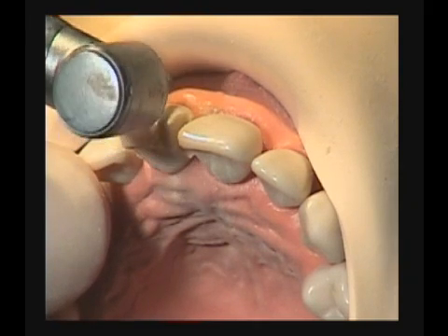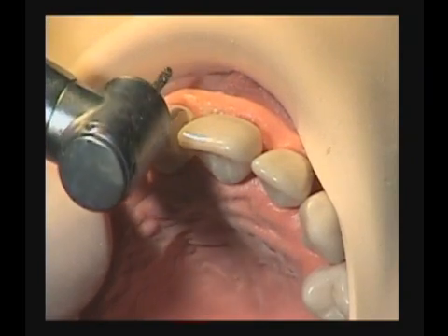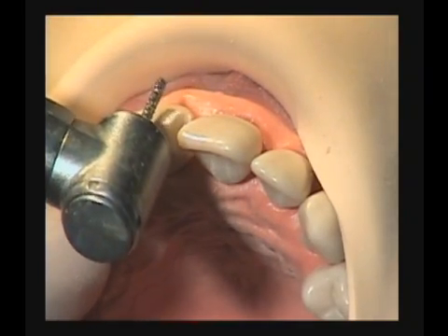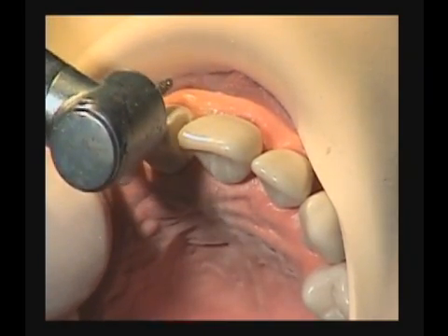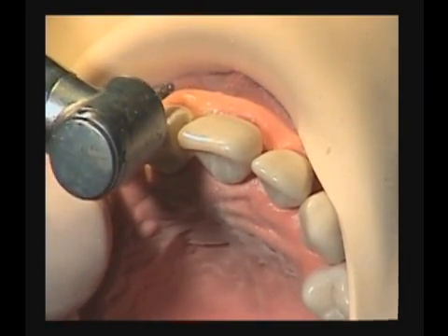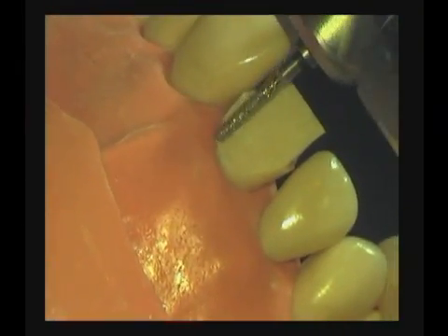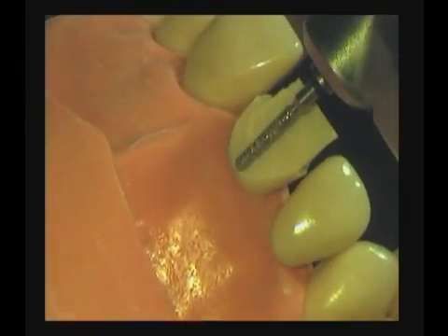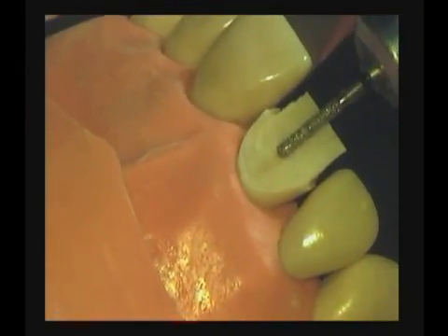Even if the tooth is slightly tipped to the facial or to the lingual, the burr must be held vertically. Also remember, the cervical plane of the tooth is at a different inclination.